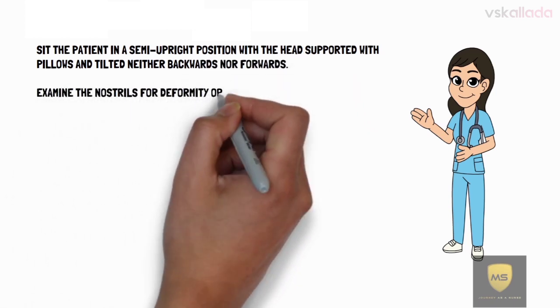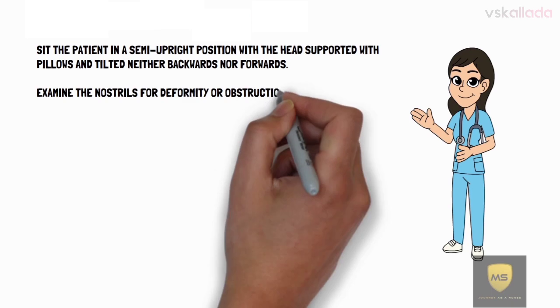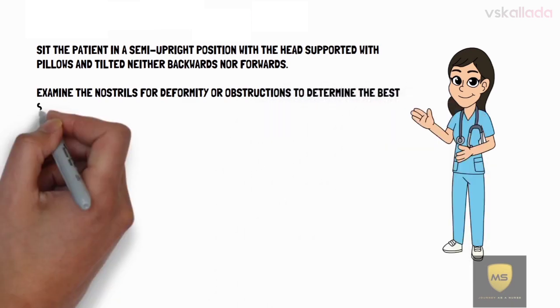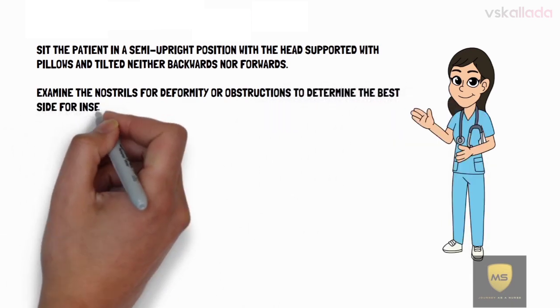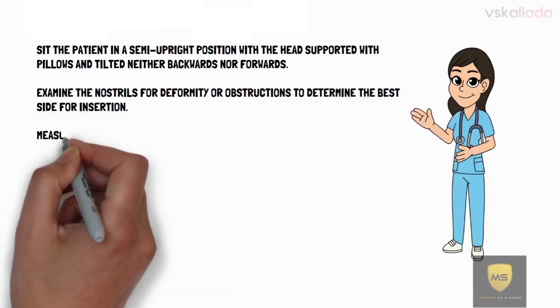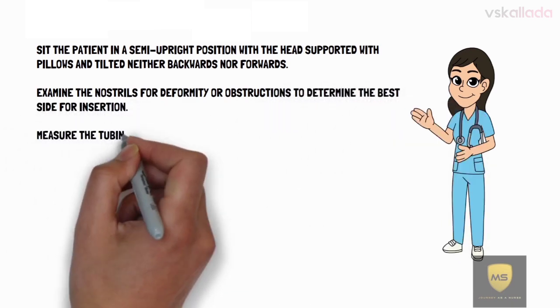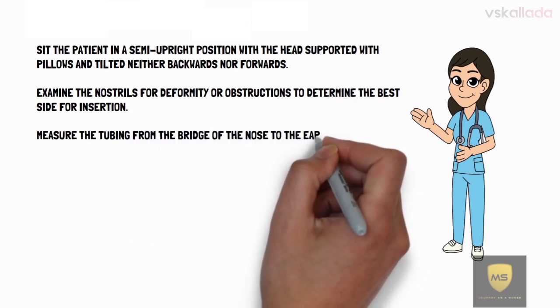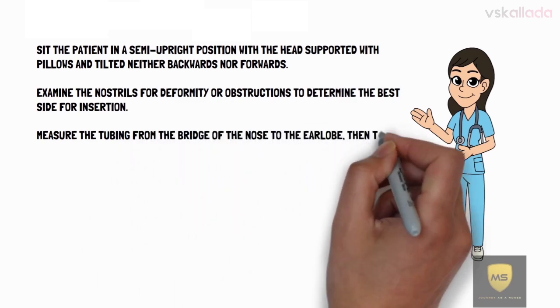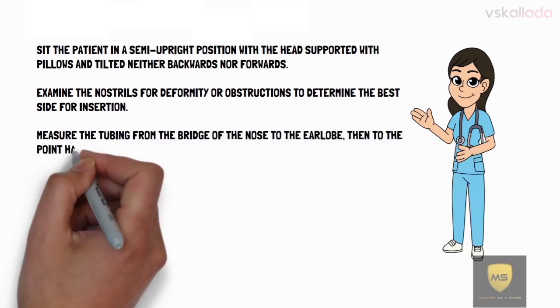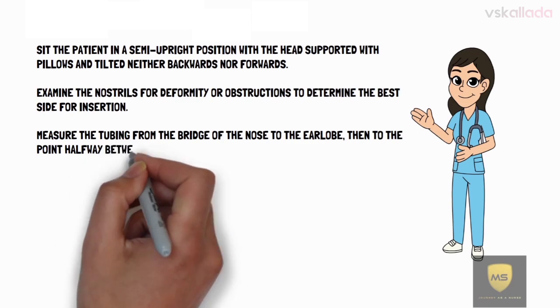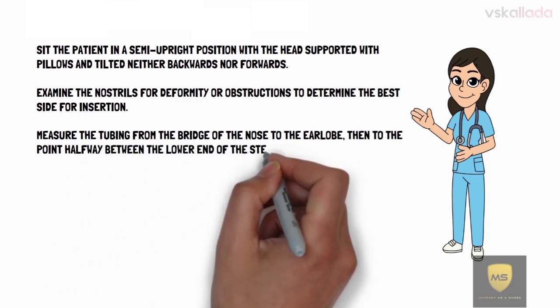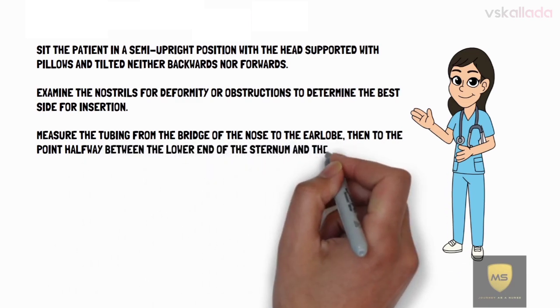Examine the nostrils for deformity or obstructions to determine the better side for insertion. Measure the tubing from the bridge of the nose to the earlobe, then to the point halfway between the lower end of the sternum and the navel.